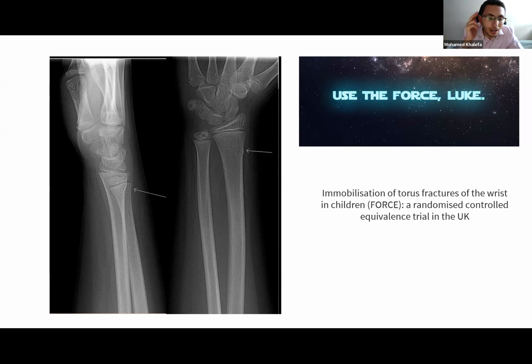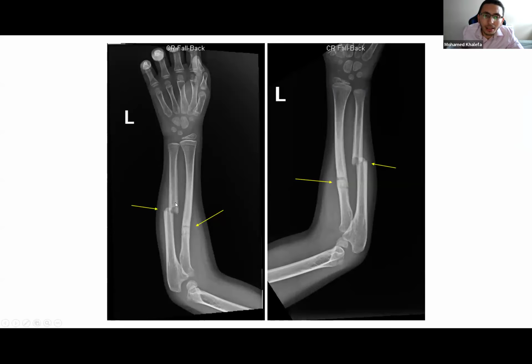But again, have a plan in your mind and say, okay, I will manage this by, again, neurovascular examination, examine everything, history, but then you can put them in a removable splint and then follow up, or sometimes phone follow-up or patient-initiated follow-up. They don't need specific follow-up, okay? Even if you leave them in a bandage or a sling, it's all fine. This is the x-ray they will see. Again, you see this x-ray, so 2 views, skeletally immature, displaced mid-shaft, both bones, transverse fractures.